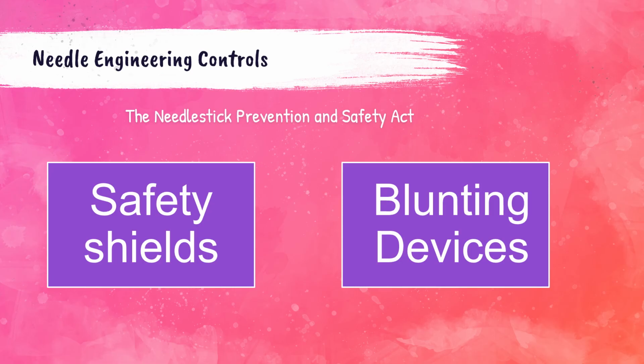The Needle Stick Prevention and Safety Act was created in the year 2000. This act revised the bloodborne pathogen standard in effect under the Occupational Safety and Health Act of 1970. This includes safer medical devices such as sharps with engineered sharps injury protections, needleless systems, and safety shields. Before using devices from different manufacturers, please familiarize yourself with how the device works before trying to use it on a patient.